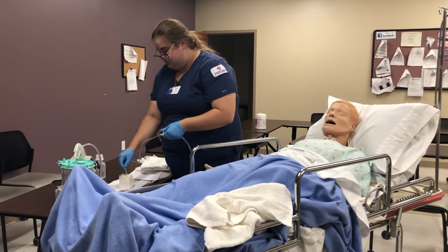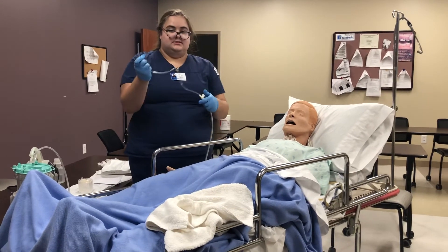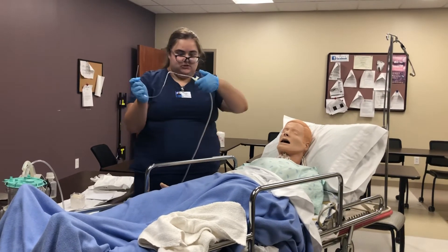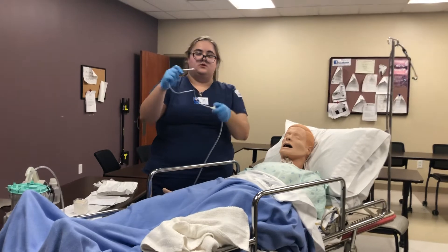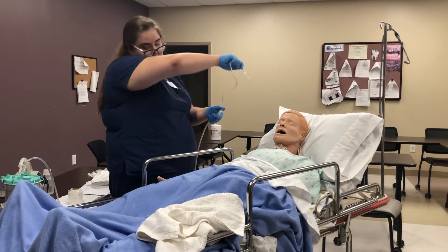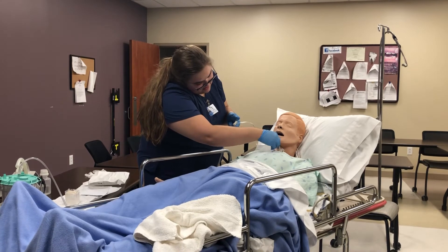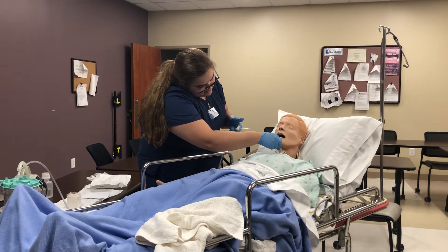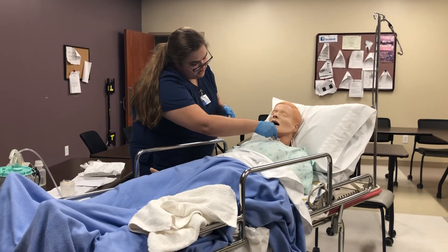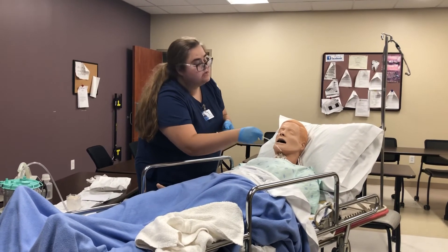Then you occlude the suction to test it. Now you are ready to suction. You want to be sure not to be occluding the suction while you insert it into the trach, because that is not good. You advance it, and then you occlude. Make sure to spin so you can get all the excess secretions out of the tracheostomy.